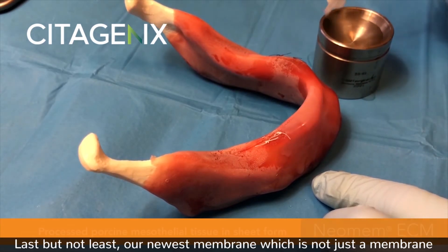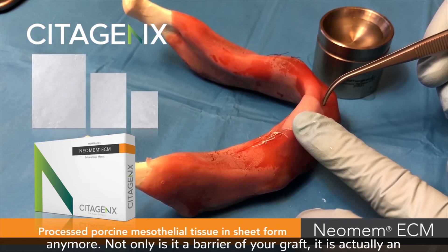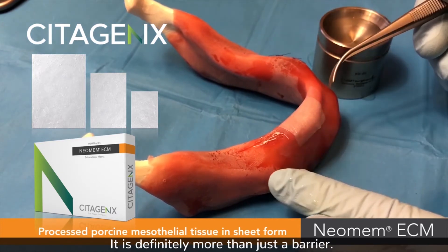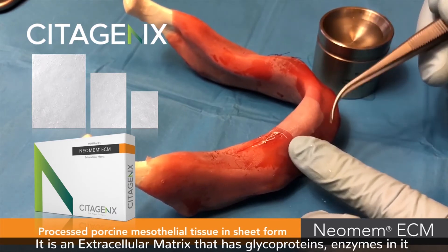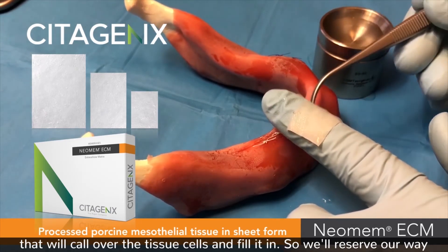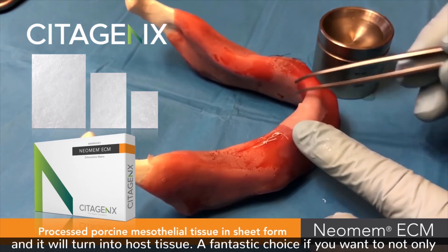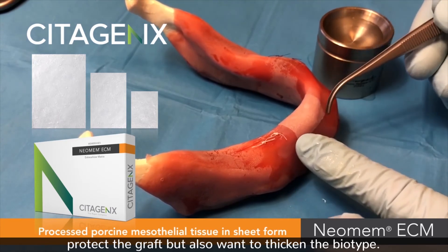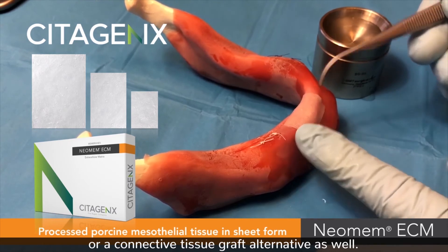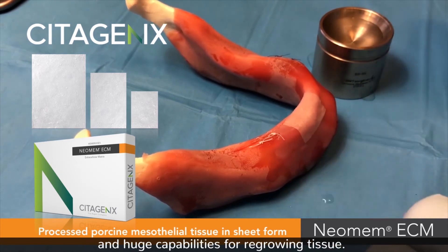Last but not least, our newest membrane — which is not just a membrane anymore. Not only is it a barrier for your graft, it is actually an extracellular matrix derived from porcine mesothelial tissue. It is definitely more than just a barrier. It is an extracellular matrix that has glycoproteins and enzymes in it that will call over the tissue cells and fill it in. It will resolve away and turn into host tissue. A fantastic choice if you want to not only protect the graft but also thicken the biotype. It can be used alone as a free gingival graft alternative or a connective tissue graft alternative as well. Really nice handling with it sticking down, and huge capabilities for regrowing tissue.